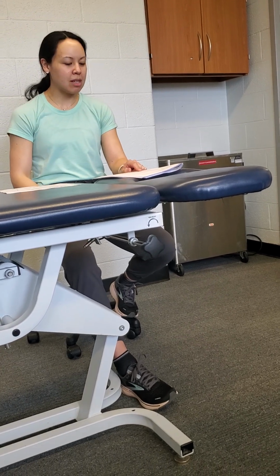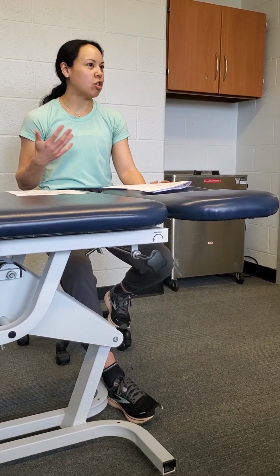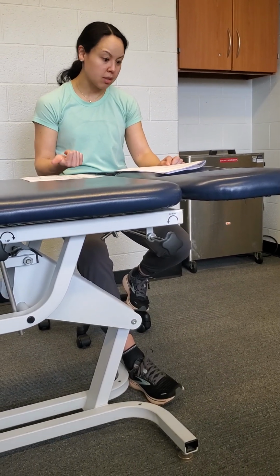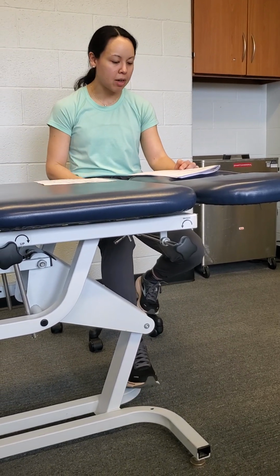Reject usually means there's an error with the reading, and it could be that the patient was talking, or the patient was moving even a little bit. Some of the things that you can do to troubleshoot: check the cuff size and snugness, check subject positioning and make sure they're completely relaxed. You want them supine and relaxed.